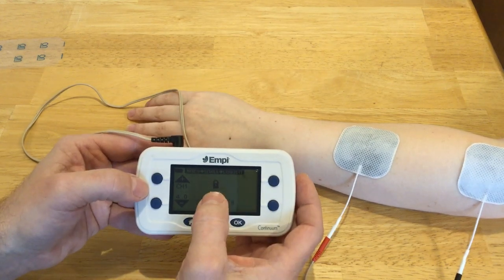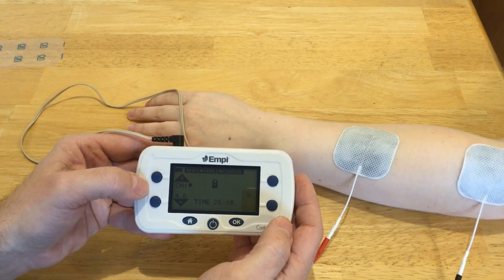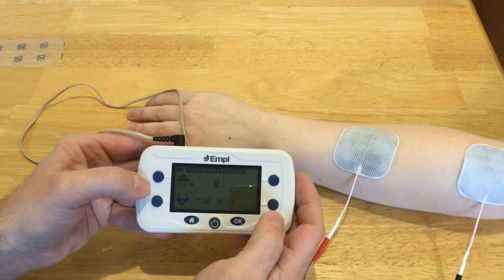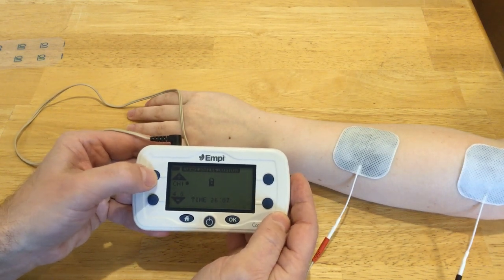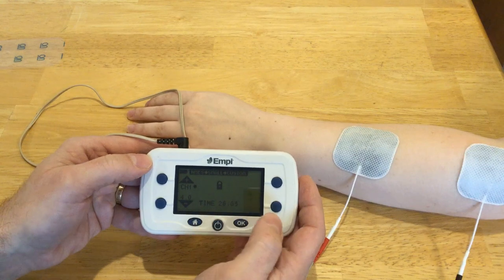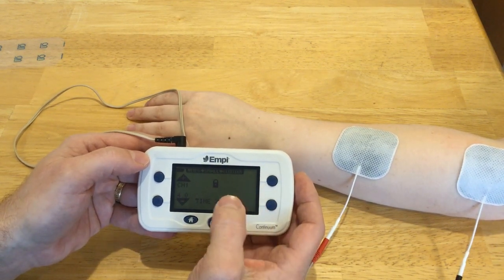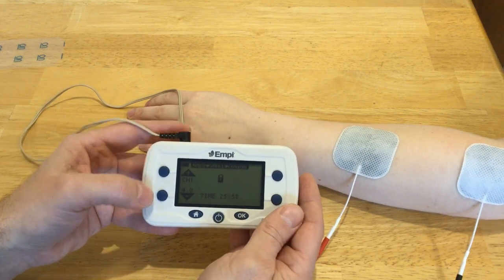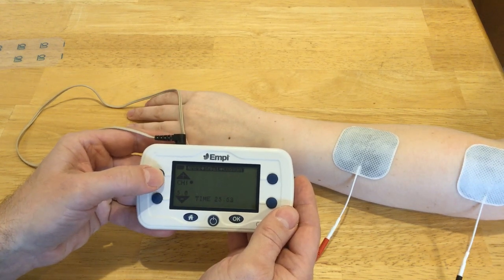We just got a padlock in the middle, which means the intensity is locked and I can't turn it up anymore no matter how much I push. That's a safety feature so that if somebody has this on, they won't inadvertently increase the intensity. To unlock it, all you do is decrease the intensity and then you can go ahead and increase some more.